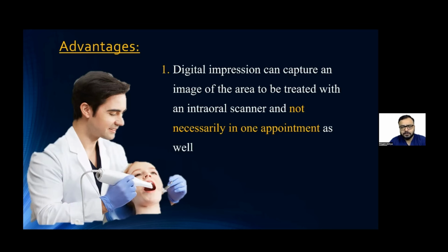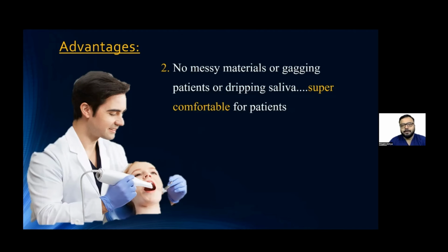Unlike impressions, where once you mix a material, let's say an A-silicone or even alginate, you are on a timer and you have to finish the procedure in that time only. Even if the patient is not comfortable at that point, you might sometimes have to push the impression. No messy materials. This is something that your patients will love. Your staff will love it even more. No messy materials, no gagging patients, no dripping saliva on you. It's super comfortable for your patients, and the secret is it is super comfortable for us also.